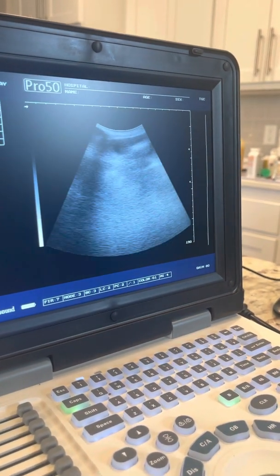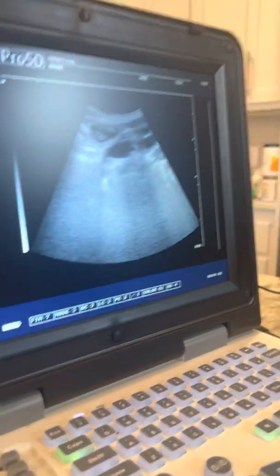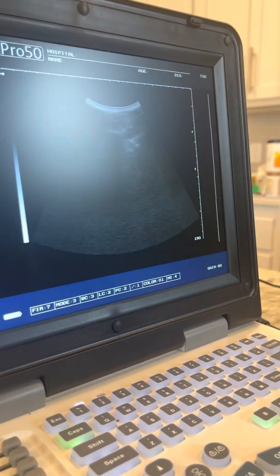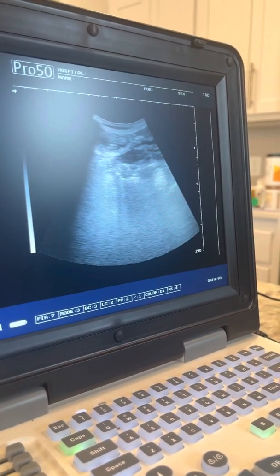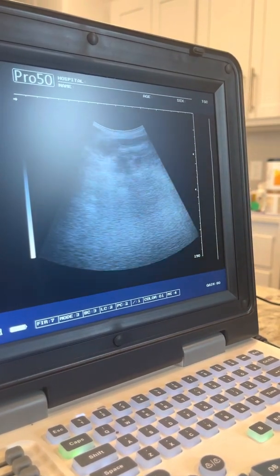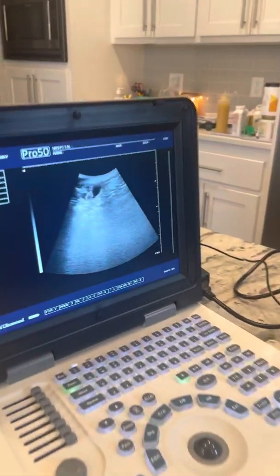You reposition it here, roll it around. So I'm showing you this image with the alcohol, and then I'm going to wipe her off and show you the quick image with the ultrasound gel. As you can see, we can confirm pregnancy for Minnie — congratulations, sweet girl. We bred her with our full fluffy stud, Reverend Fluffy. You can get a great image of this baby right here.